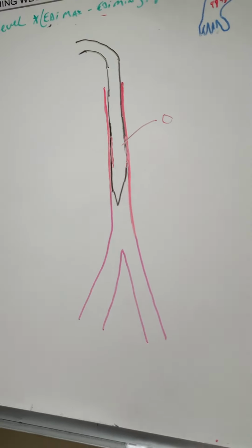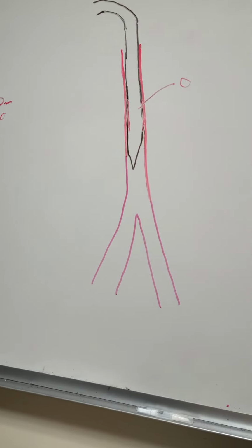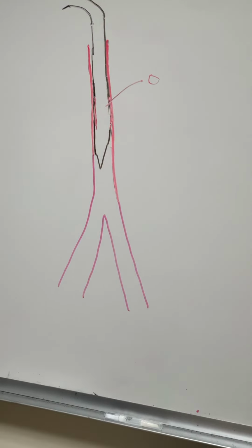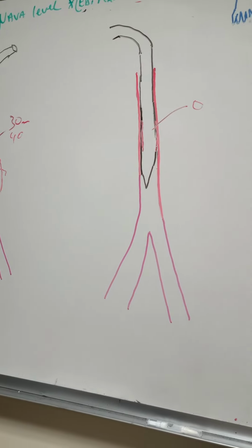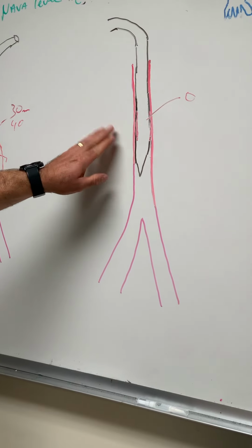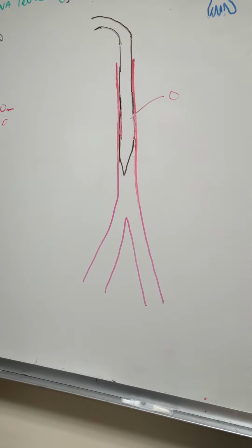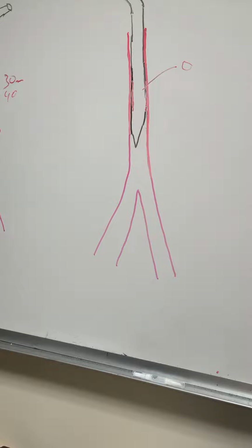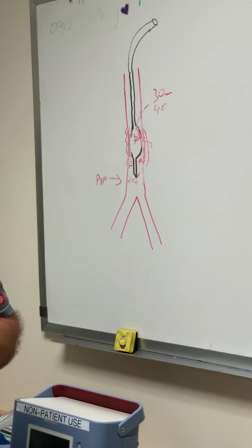We have the cuff deflated and he's on positive pressure ventilation and his peak airway pressure is 28 centimeters of water pressure. Or let's say it's 20, let's forget 28, let's say it's 15. Let's say he's pretty compliant, right? So we know that at a PIP of 15, we do not have a leak around this cuff, because we have the cuff deflated and there's no audible leak when we listen with our stethoscope. So we know that the leak is somewhere above 15, but we don't know if it's 16, 17, 18, 19, 20, 28, 50. We have no idea.